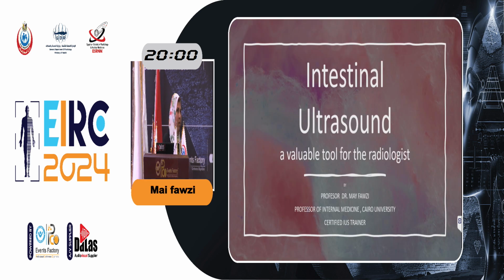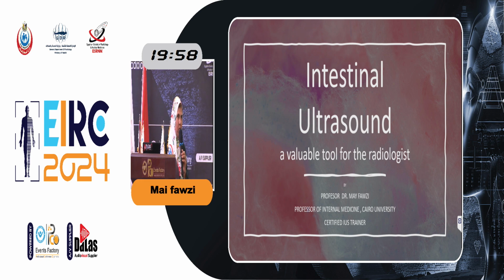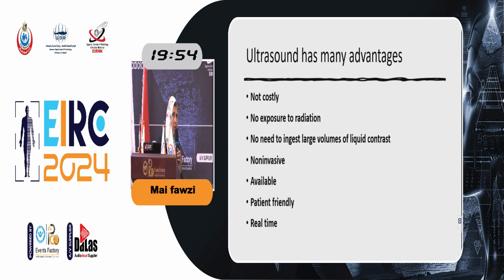My talk is about the importance of intestinal ultrasound for the radiologist. I do not need to mention the importance of ultrasound. You all know how non-invasive it is, and that it does not need any IV contrast. You don't have to expose your patient to ionizing radiation, so it's really very patient-friendly as well.